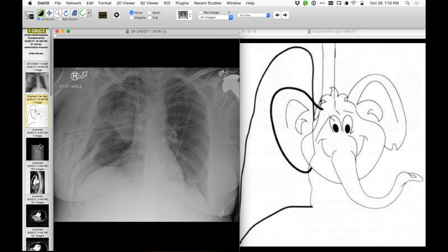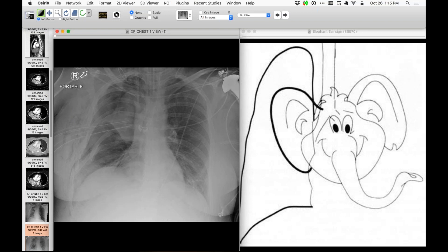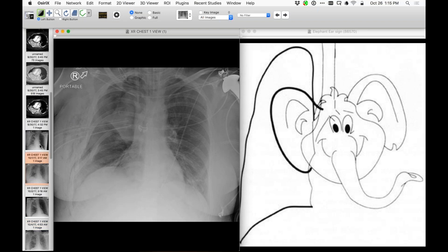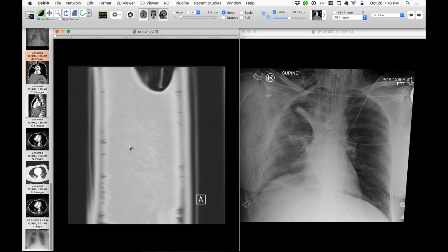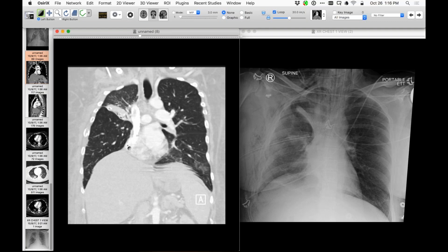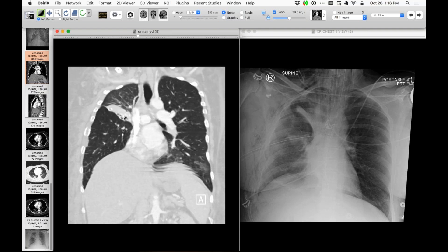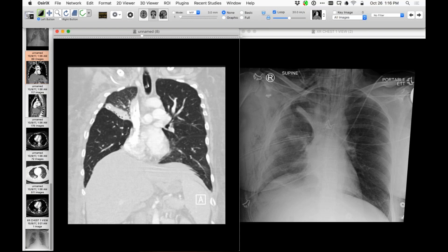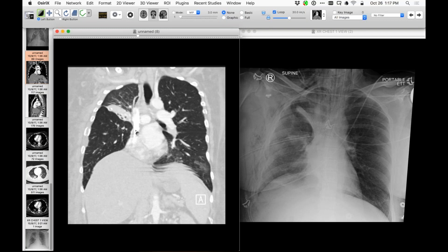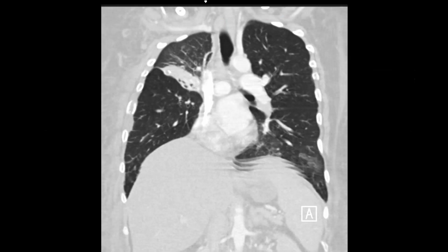I think what makes this case unusual — and I think you're absolutely right that this is middle lobe plus upper lobe atelectasis — it's strange, because normally the middle lobe stays anterior. But because of the large pneumothorax in this case, everything sort of flopped posteriorly and then got stuck there. So the middle lobe is surprisingly posterior. The right lower lobe expanded a lot and filled the space where the right middle lobe is, so the right middle lobe can't fall back down to where we usually see it. This is all right lower lobe — and here's the middle lobe sitting in there, with the bronchi going right to the medial lateral segmental bronchi.